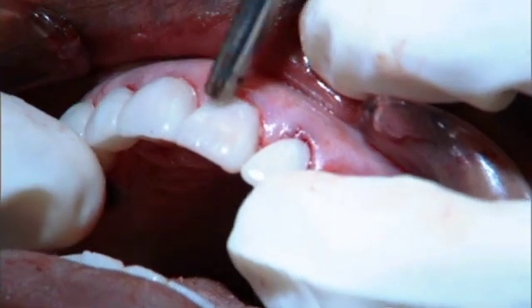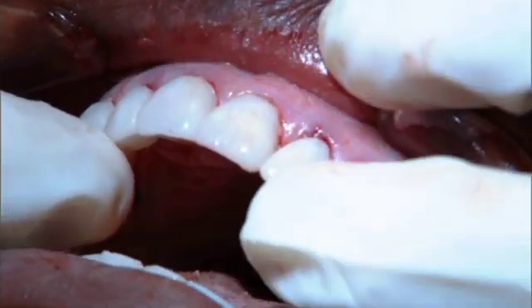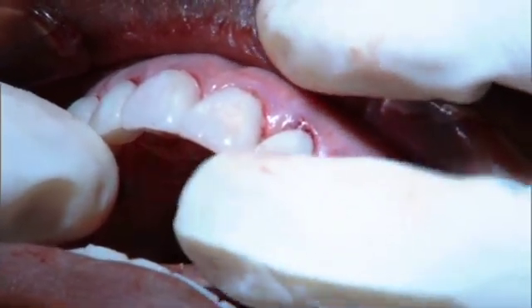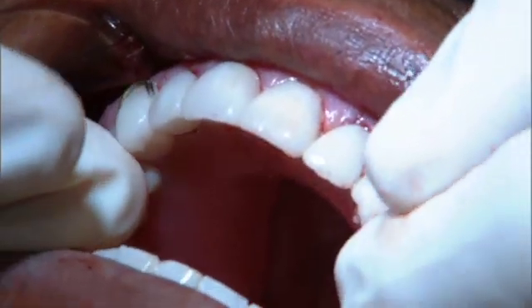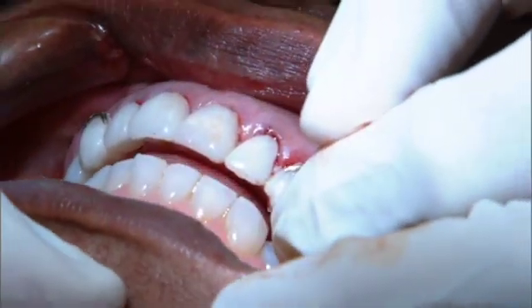This is why fixed and removable prosthetics to me is the hardest job in dentistry. You have to understand the concepts of fixed dentistry, but you also need to understand the concepts of removable dentistry and blend those to get your final result. Let's let your jaw relax again for me. Close on your back teeth.